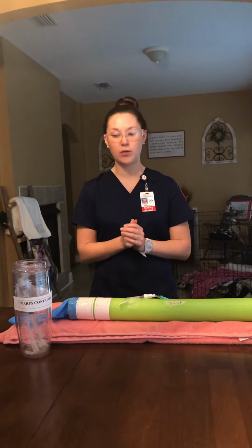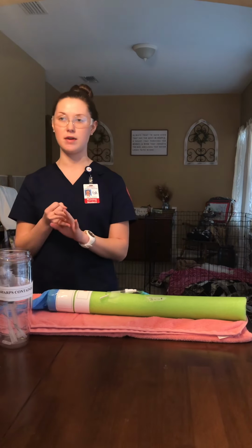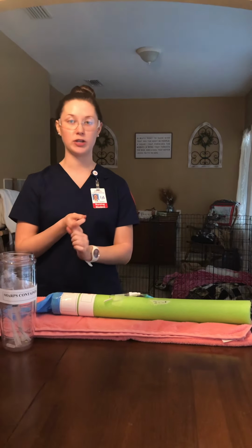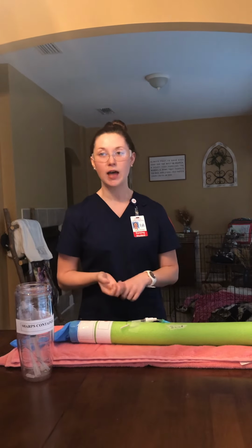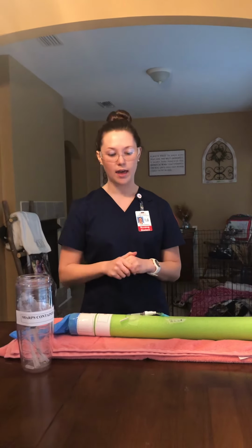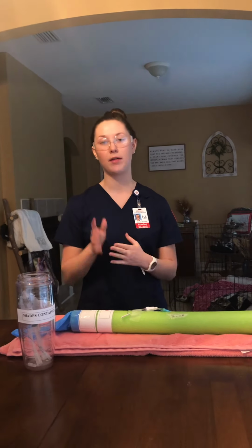So now I'm going to perform hand hygiene, and then I'm going to do documentation. So for documentation, I would need to document the date, the time, the location, the catheter gauge and length, as well as how the patient handled the procedure. I would also need to document the number of attempts, as well as the presence of the saline lock, and also the flow rate, as well as the method of infusion if fluids were prescribed.